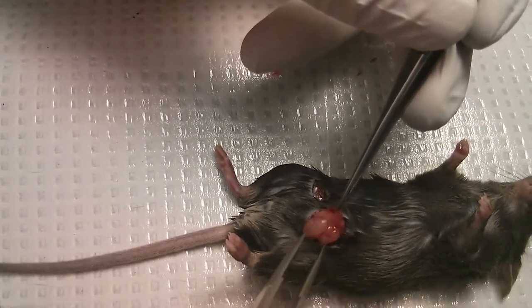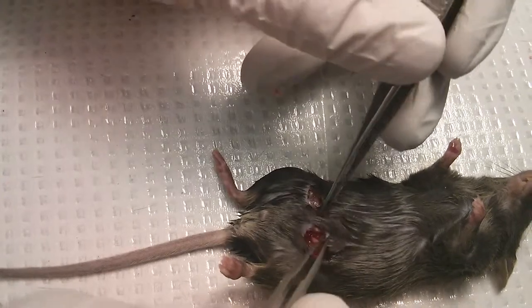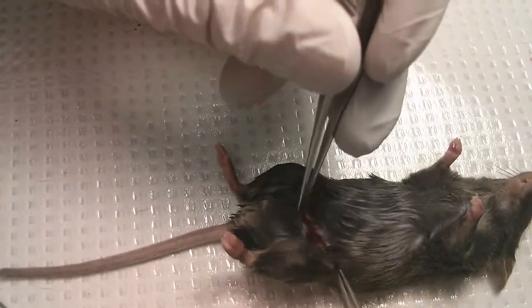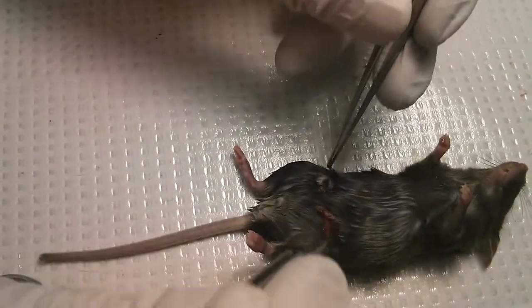It's good to use a blunt one — it's better, the blunter one. And you can actually use just a staple to close. On both sides — this is something you do on both sides. I just showed you once, but do the same on the other side.